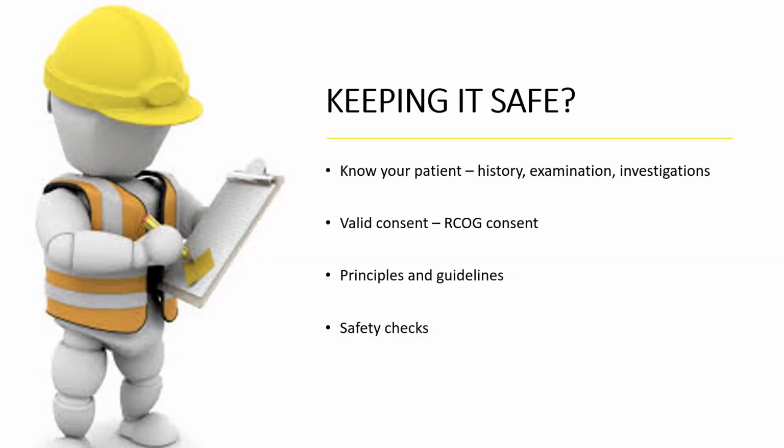We keep it safe by making sure we know our patient well, both in the history, examination, investigation, everything is clear. We keep it safe by having a valid consent. There is an example of a Royal College consent for hysteroscopy, which could be used, or on those lines. We use principles and guidelines of hysteroscopy, and we should have safety checks.